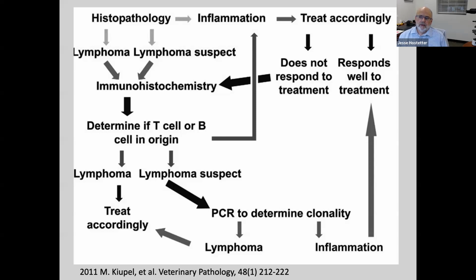What they're really talking about with crypt attenuation is crypt change. They're talking about dilation of the crypt and infiltration of neutrophils and material into the crypt, and that will happen in the colon as well. And so that's what that crypt change is about. The goblet cell loss is, in my interpretation, part of hyperplasia and loss of differentiation.